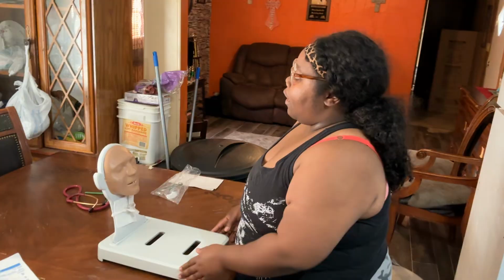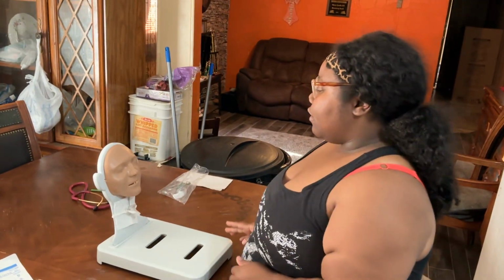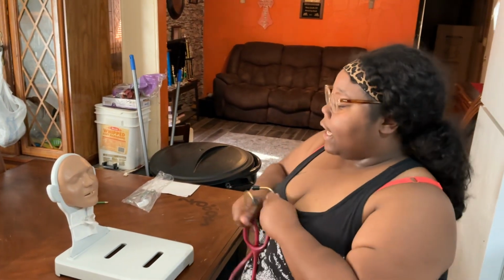All right. Have you had any trouble coughing or anything? Or you've been coughing? Okay. So she's been coughing. All right. So what we're gonna do is I'm gonna assess your lung sounds first. Then I'm gonna provide you with trach suctioning and trach care. Is that okay? Have you had that procedure before? She said yes. She's had that procedure before, and that's okay. So, all right. Before I get started with anything, I'm gonna go ahead and listen to your lung sounds. Is that okay? She said yeah. I have permission.